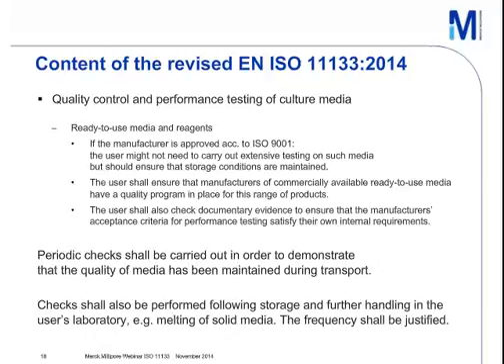Nevertheless, periodic checks shall be carried out in order to demonstrate that the quality of media has been maintained during transport. Checks shall also be performed following storage and further handling in the user's laboratory, for example, melting of solid media. Also for this, the frequency shall be justified.